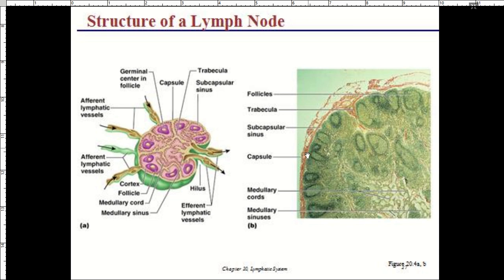So histologically, you can actually see here that this is your connective tissue that will form the what? The capsule. So the capsule is made by dense irregular connective tissue. And behind the capsule, you're going to have a space or a sinus that is called the subcapsular sinus, right? This subcapsular sinus will proceed as the trabecular sinus. Right. So we have trabecular sinus, paracortical sinus, medullary sinuses, and then we end up having what? These medullary sinuses that will join to form the efferent lymphatic vessel.